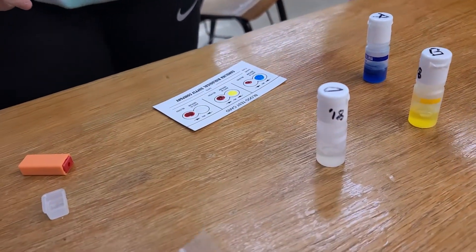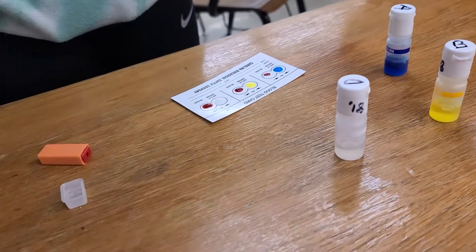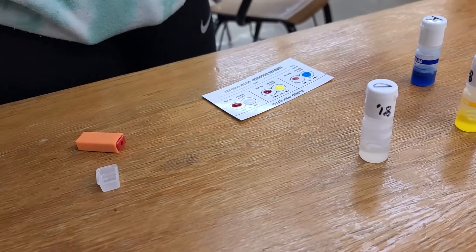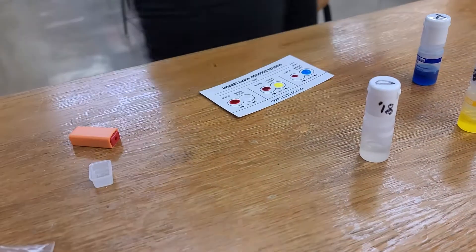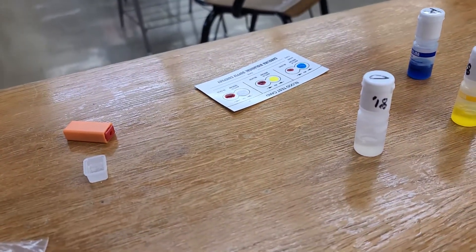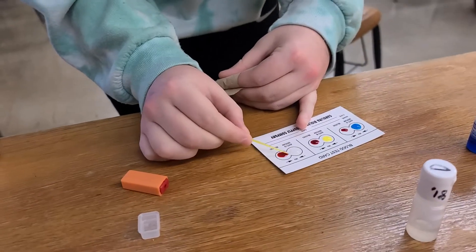Now we're going to get sticks and mix them. You can grab a piece of paper towel if you need to. Do you need a paper towel?